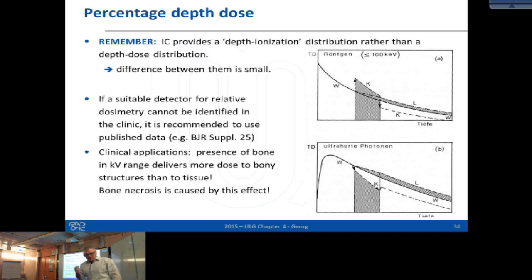I don't go into any details about treatment planning and dose calculation for X-ray therapy, because that's really very simple. And from a conceptual point of view, when we do later on empirical dose calculation for photon beams, in the same way we can apply the algorithms and the same factors for kV beams. In the same way we can also build up an algorithm, a simple one, for electron beams. But there is one big difference between photon beams in the MeV and in the keV range, and that's related to the absorption coefficients in this energy range.